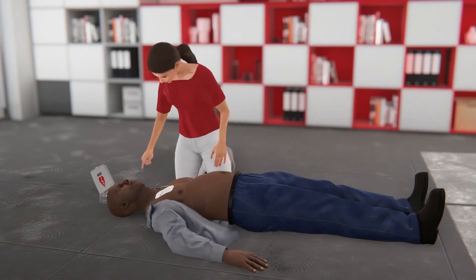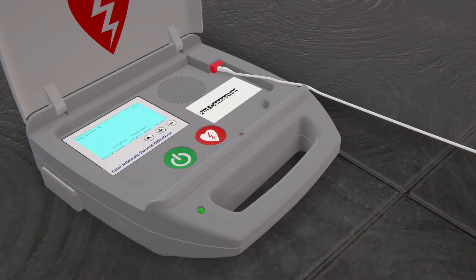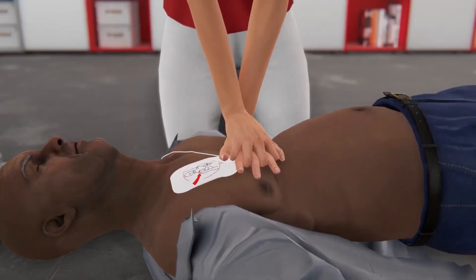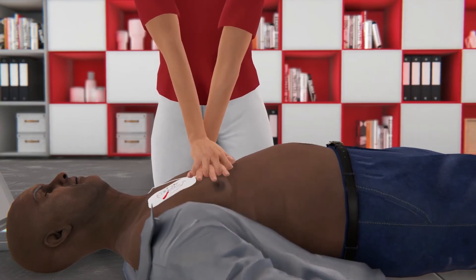You will likely need to repeat several cycles of compressions and shocks. Begin CPR, starting with compressions. Follow the prompts from your AED until help arrives. Try not to interrupt compressions for more than 10 seconds.